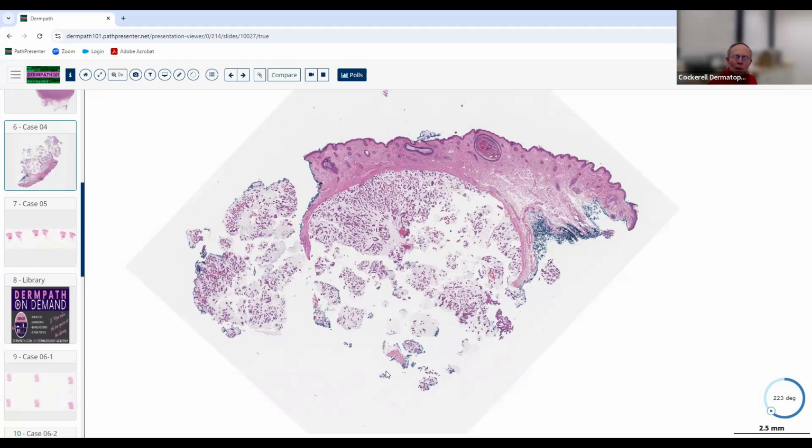And sometimes if you see something that looks conflicting like that, it might be malignant, but it might be a very low grade biologic malignancy. For example, like a basal cell. Sometimes you'll see a nice nodular basal cell that looks fairly small and symmetrical. That's a cancer, but it's not going to spread and kill the patient like malignant melanoma, or like a poorly differentiated Merkel or something like that. So it might be malignant, but it may be low grade. Okay, good. Anything else you can tell at low power before we go to higher magnification?